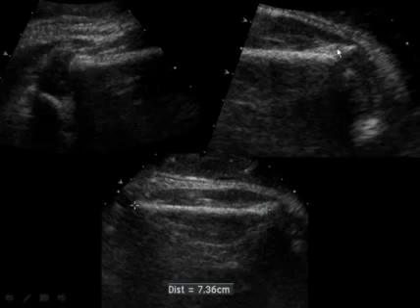And then at the far end of the femur, here's that distal femoral point and the epiphysis with a little bit of ossification in the center, and this is where the cursor belongs, at this end of the femur. And this gives us a more accurate femur measurement when these landmarks are used, of 74 millimeters.